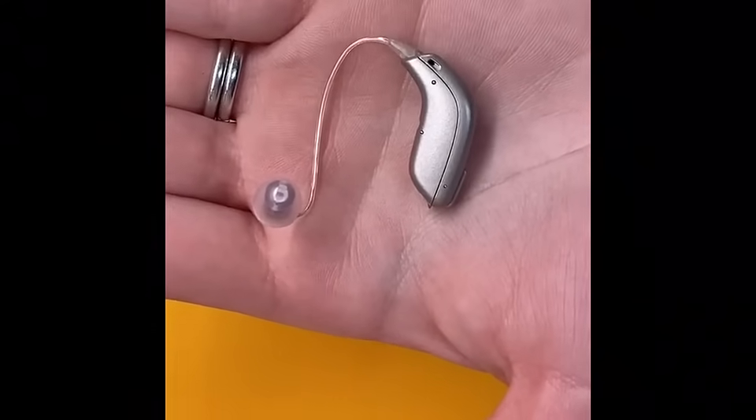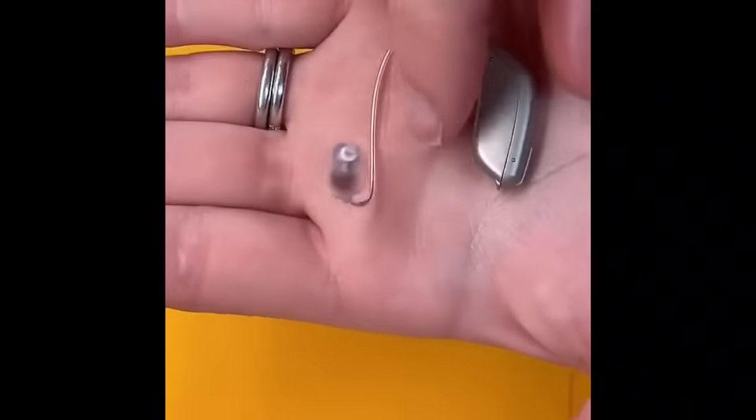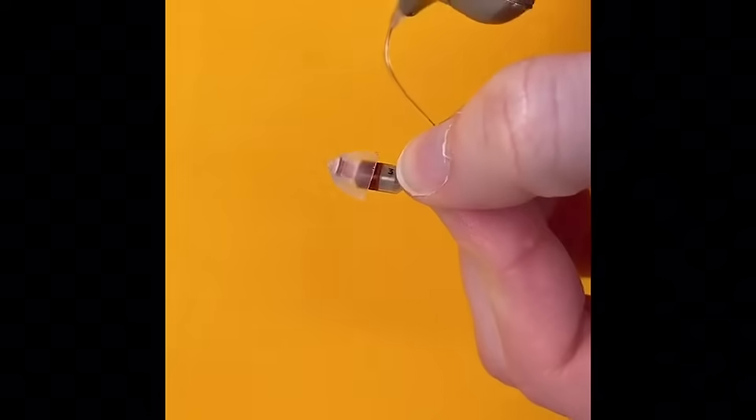This video will show you how to change the dome for an Oticon receiver in the ear product. The dome is this clear plastic piece on the end.